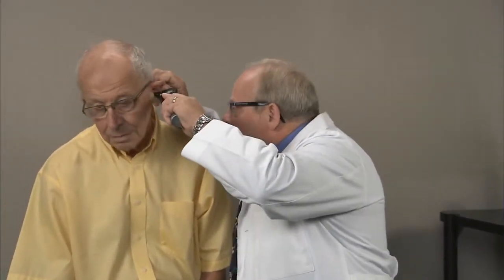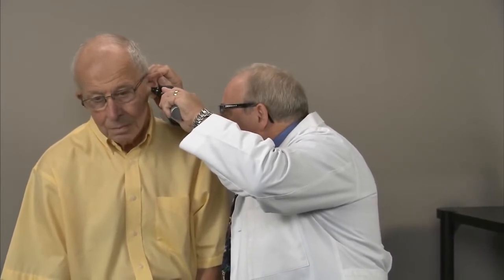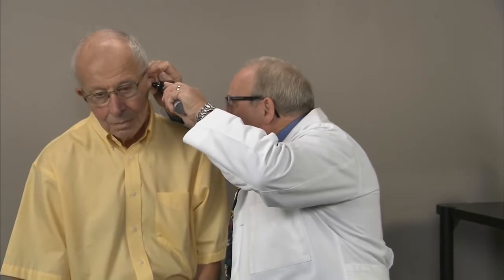Once again using my otoscope, I can examine the ear canal. I find that he's got a little bit of fluid behind the eardrum, but I don't see any evidence of infection — the wax is removed. I think that's the reason you were having the muffled hearing and the pain. That fluid should resolve on its own over the next week to 10 days; you should be fine and don't need any antibiotics.